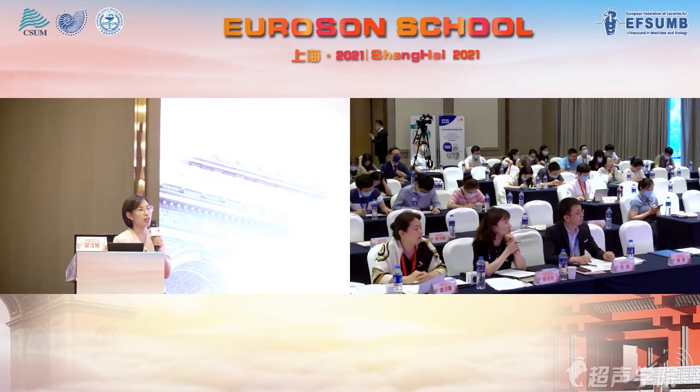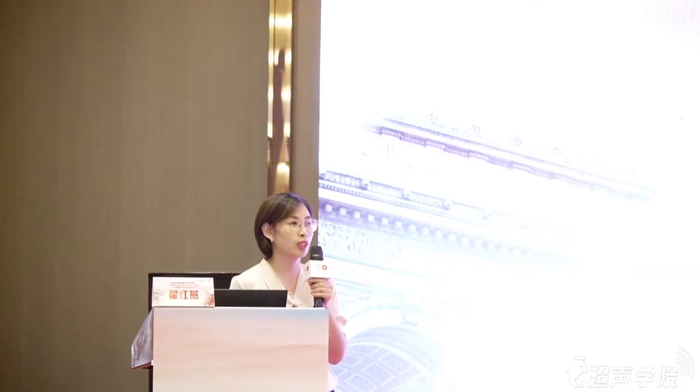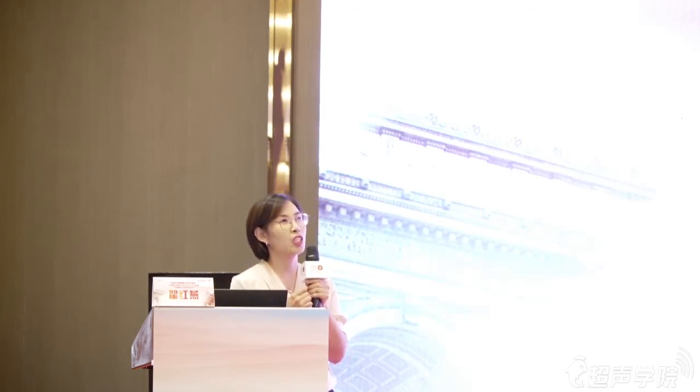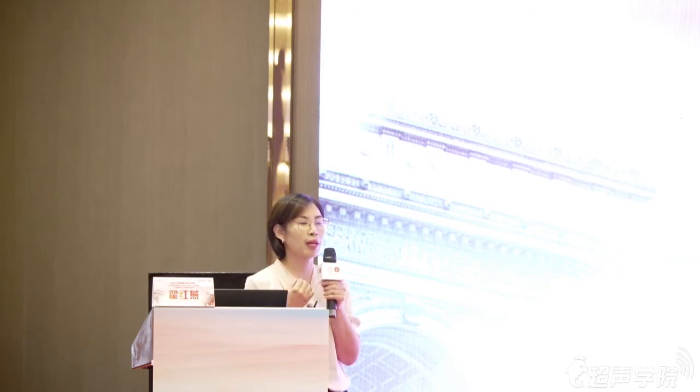After the conventional ultrasound examination, we thought that it might be a pancreatic tumor. So we wanted to make a differential diagnosis among solid pancreatic tumors using CEUS. Pancreatic adenocarcinoma usually showed hypoenhancement in the arterial phase, and the enhancement pattern of focal pancreatitis is similar to the normal pancreatic parenchyma and often showed isoenhancement in CEUS. And the neuroendocrine tumor has abundant vasculature, so it may show obvious hyperenhancement in the arterial phase in CEUS.